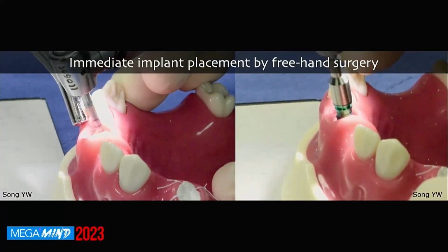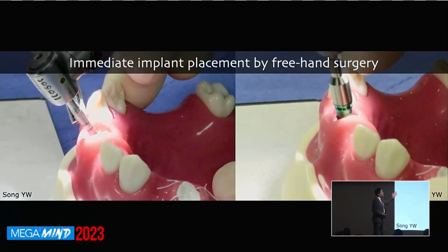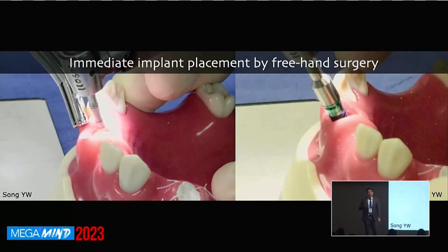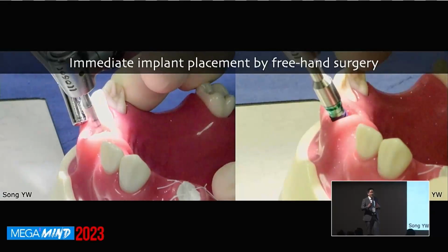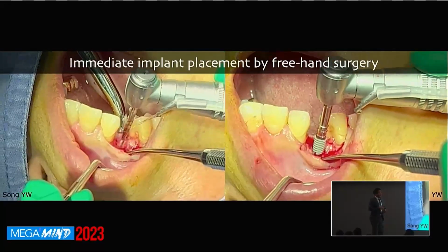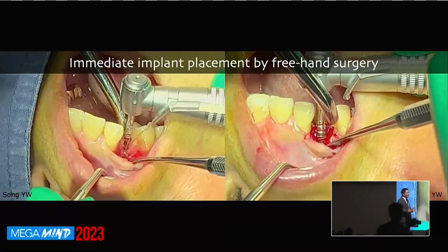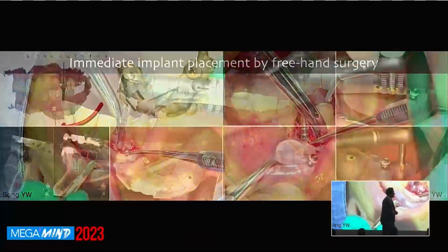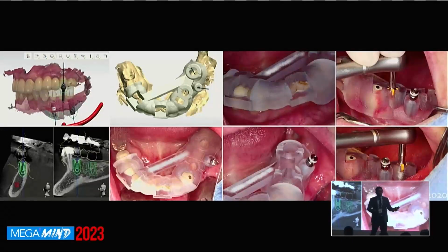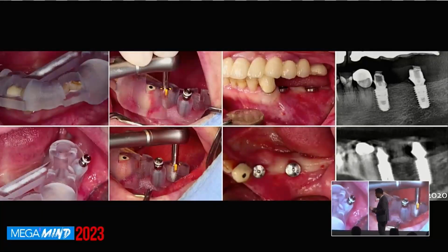So what we do during implant placement in the extraction socket is modify the path during the drilling as well as during the installation, because this optimizes the accuracy. Most of us would say this is not a difficult process, but I can definitely tell it is not easy. And sometimes for me, honestly, it is quite stressful. But now we have digital dentistry-based, fully guided implant surgery, which allows us to place the implant as accurately as possible based on what we planned before.